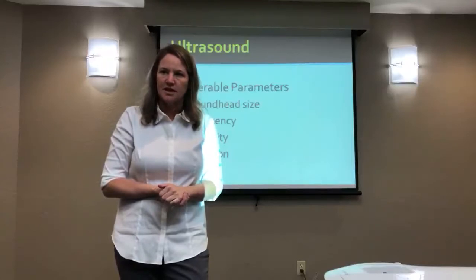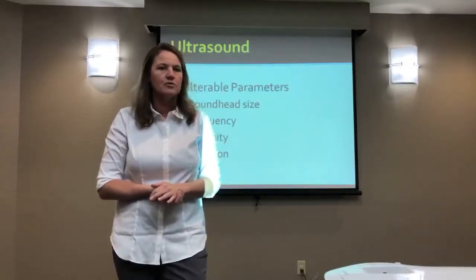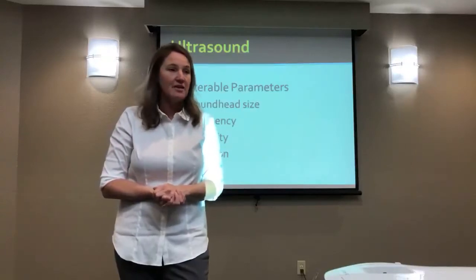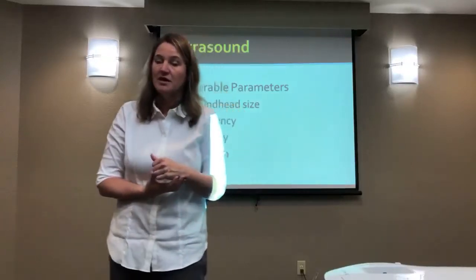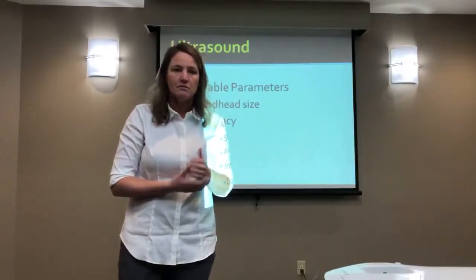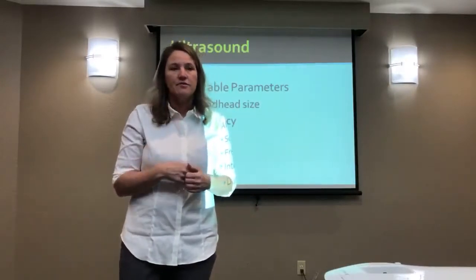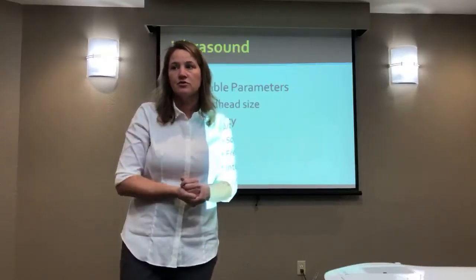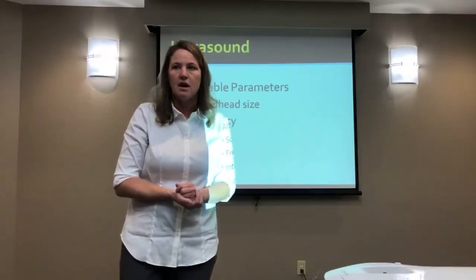Your arm is going to get tired. They're going to get bored. Ultrasound is a boring treatment to deliver. It may be fun to receive it, can be very soothing, but it requires you to do repetitive overlapping movements over the area. From an outside perspective looking in, a lot of people look at the delivery of ultrasound and it appears to be non-skilled.